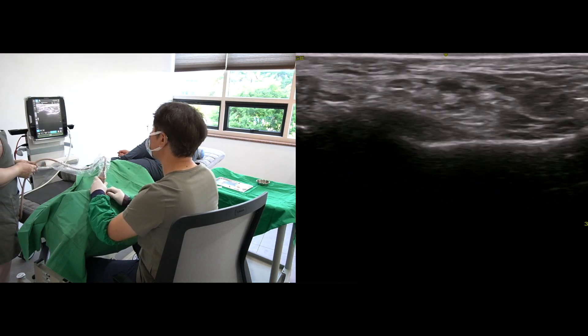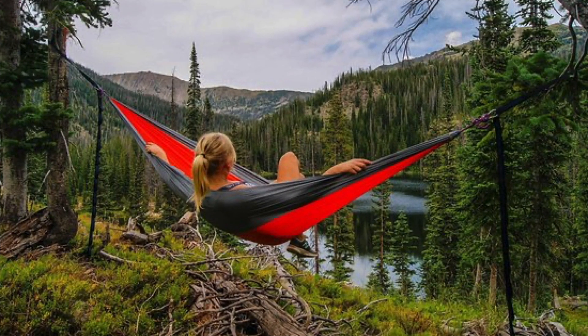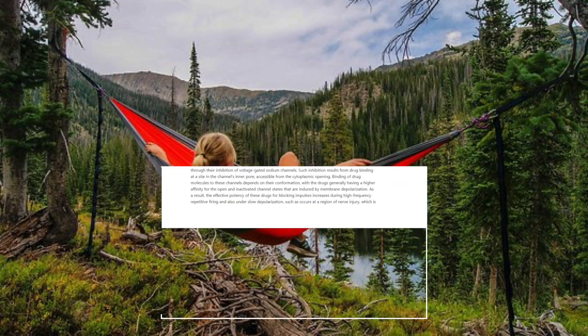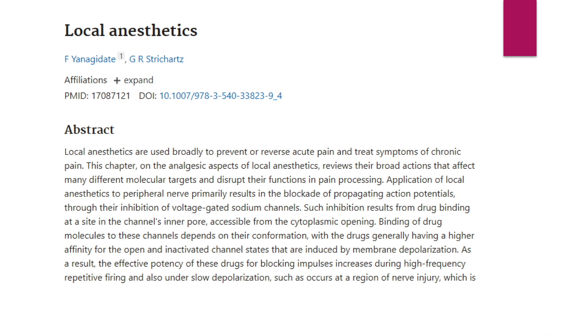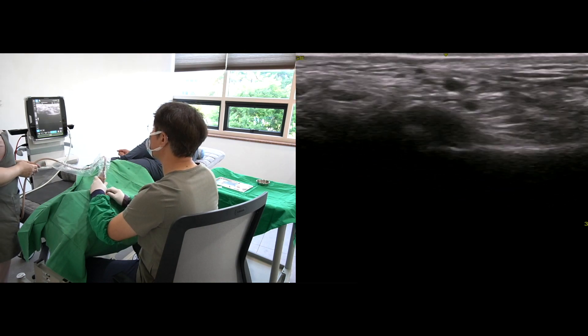There are two advantages of the tibial nerve block. The first is to prevent procedural pain and make the procedure comfortable. The second benefit is the chronic pain-relieving effect of the local anesthetics.